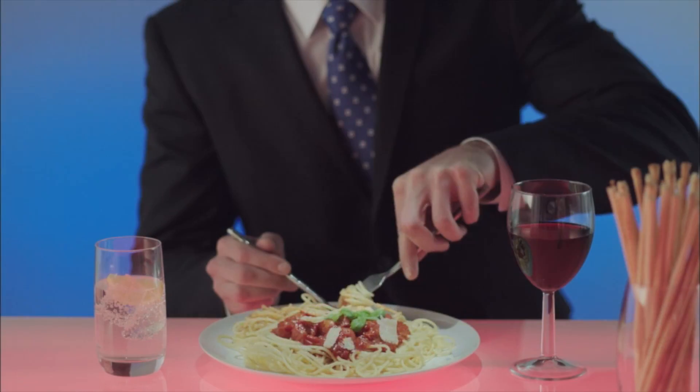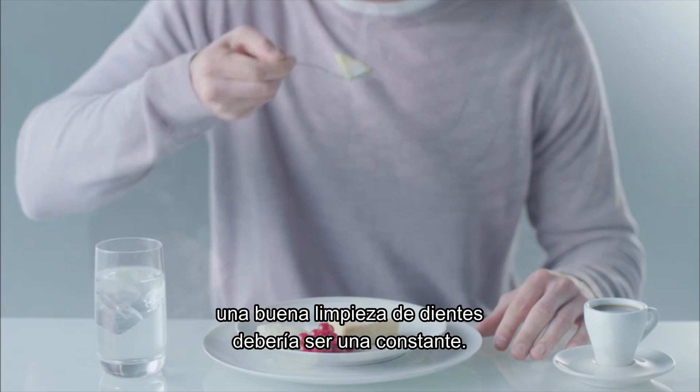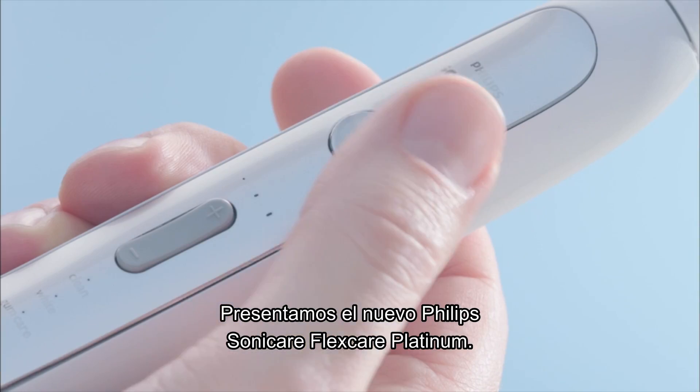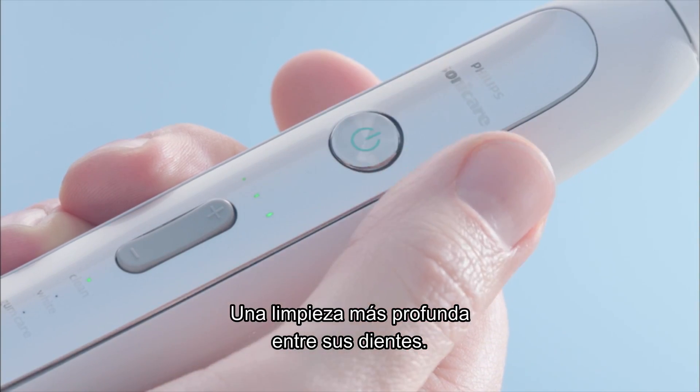Every day is different, but no matter what else changes, a deep clean for your teeth should always be a constant. Introducing new Philips Sonicare FlexCare Platinum, a deeper clean between your teeth.